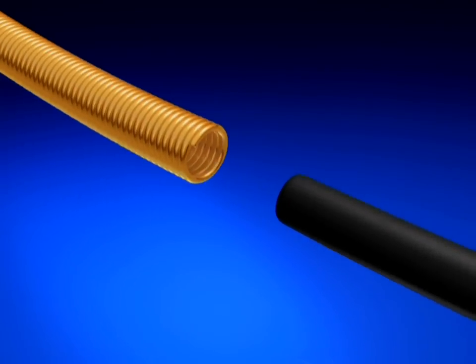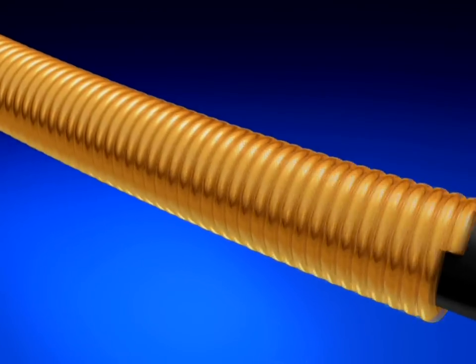The One Snare Loop is constructed of nitinol wrapped with gold-plated tungsten, which provides strength for shape retention as well as accurate visibility under fluoroscopy.